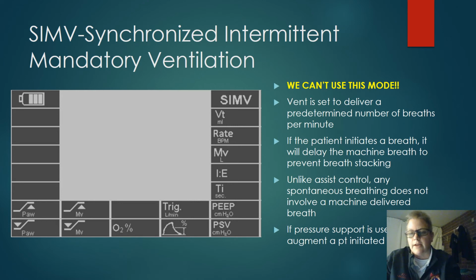So please, here at Canyon, we don't have that designation now. Don't use this. I clarified with Carrie, because I tried to say, hey, this is a volume controlled mode. But she said that the EMS Physician Commission had dubbed it an advanced mode. Whether I agree or not doesn't matter.